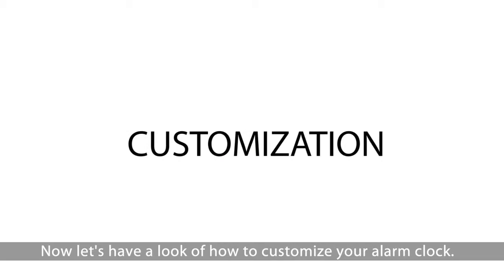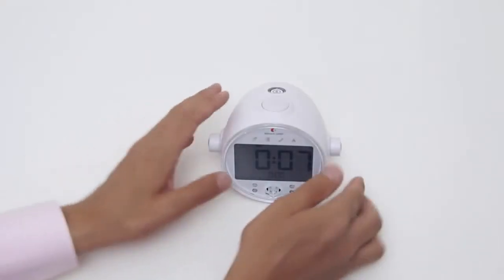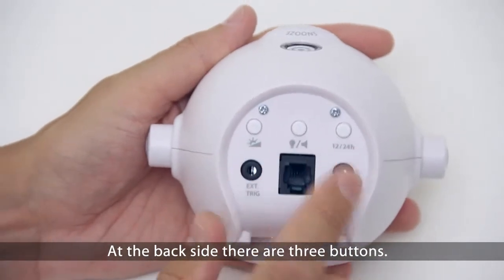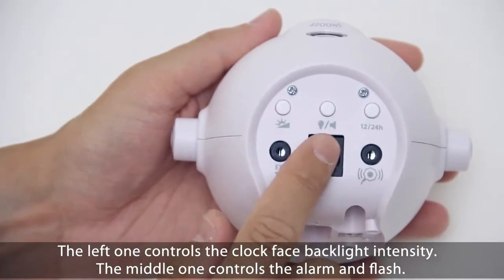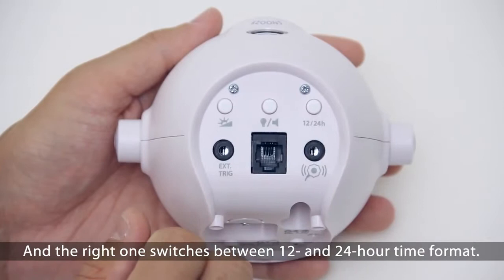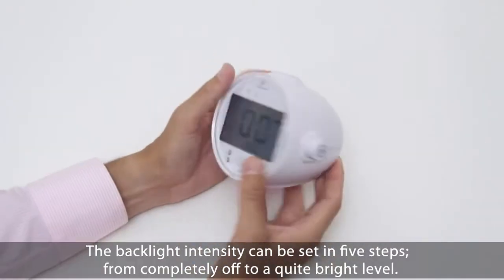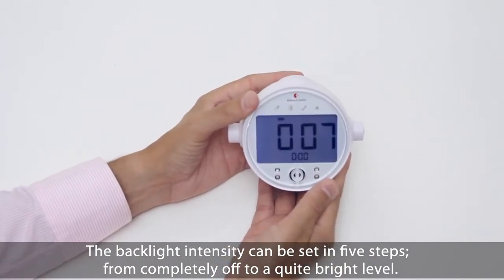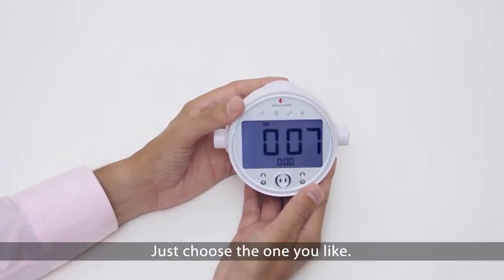Now let's have a look at how to customize your alarm clock. At the back side there are three buttons. The left one controls the clock face backlight intensity. The middle one controls the alarm and flash. And the right one switches between 12 and 24 hour time format. The backlight intensity can be set in five steps, from completely off to a quite bright level. Just choose one you like.